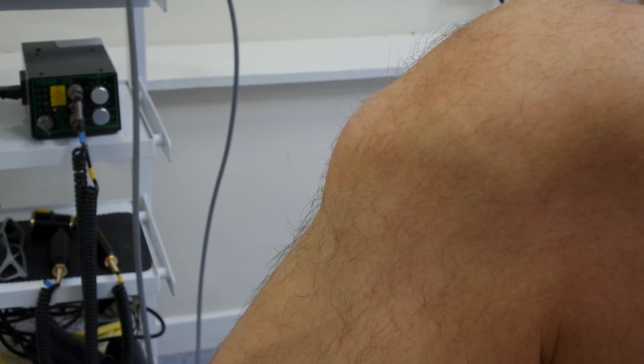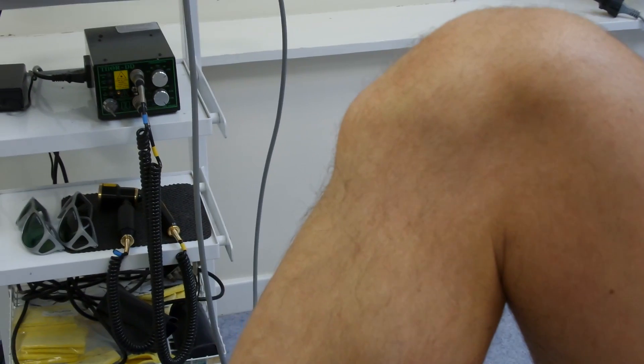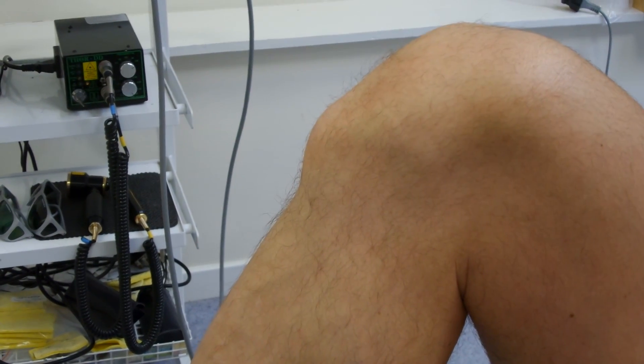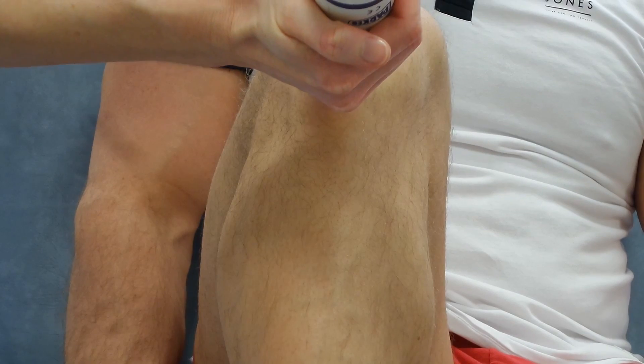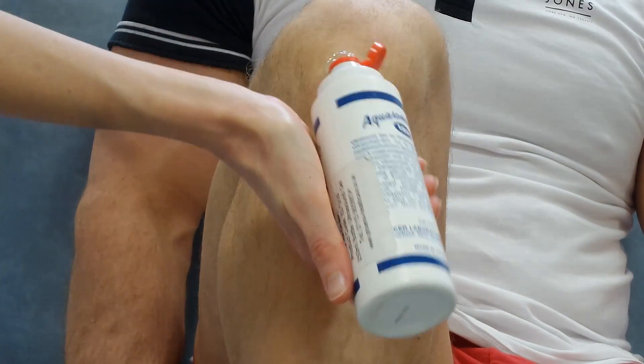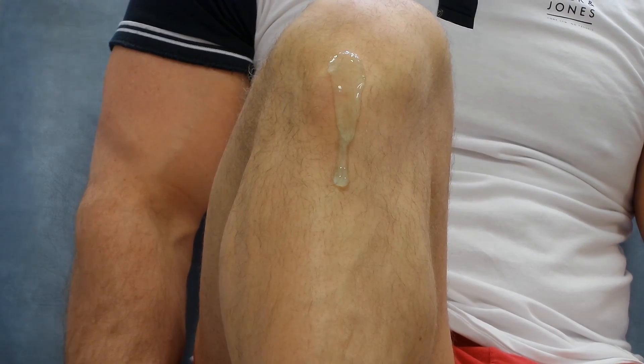You can see the Osgood Schlatter's on the knee here — it's quite prominent, a large area of bony formation. It's important to emphasise that this is a mature knee; this is not a knee with open growth plates. Gel is then applied to the area to be treated.